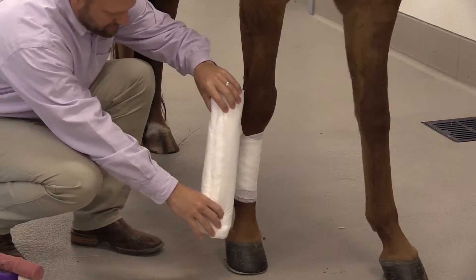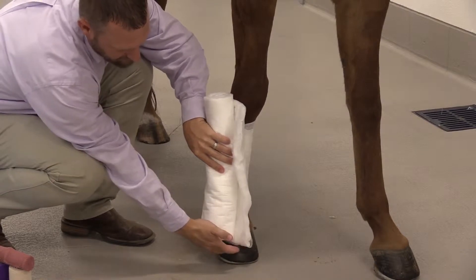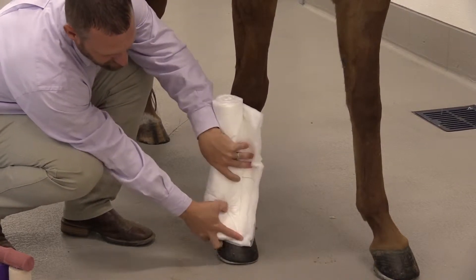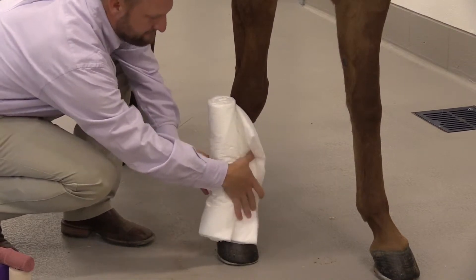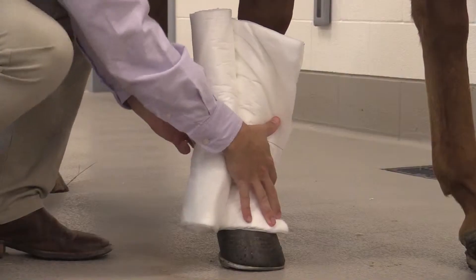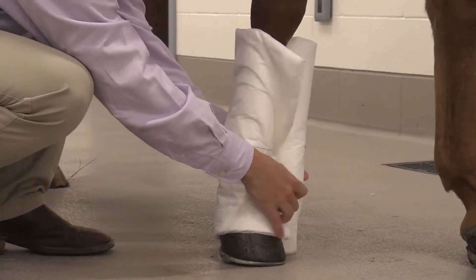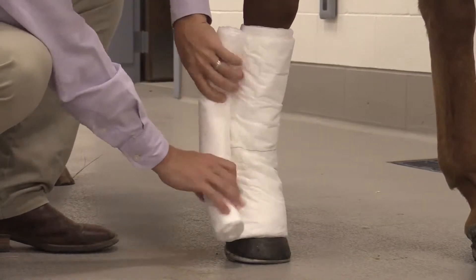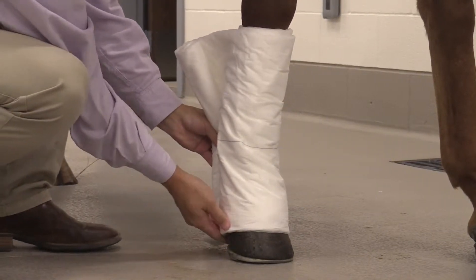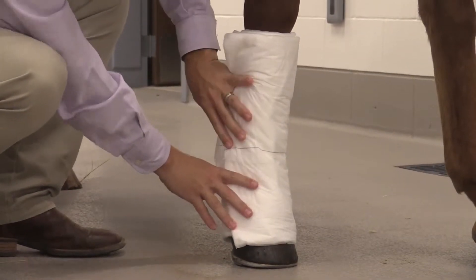Next, we will start with the support wrap bandage material, beginning with the leg cotton or the combi roll. Demonstrating that we're going to be below the coronary band, or starting on the hoof capsule — sometimes even starting completely at the ground will help with that. We go around in the same direction as we did with the crinkle gauze with this combi roll.